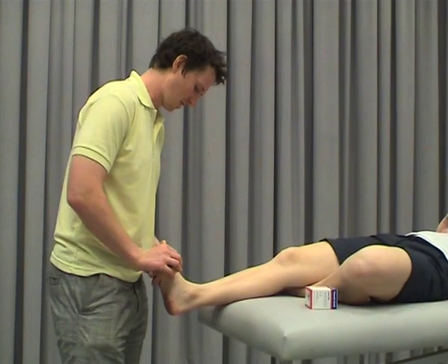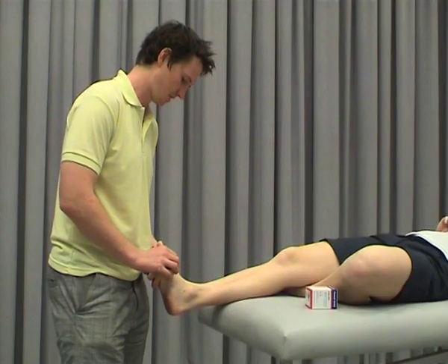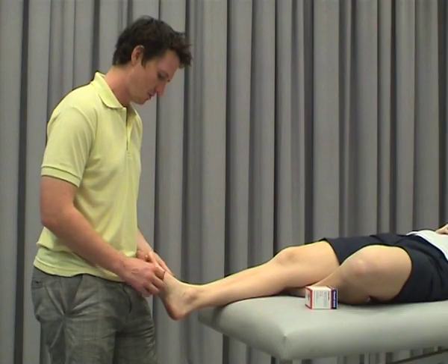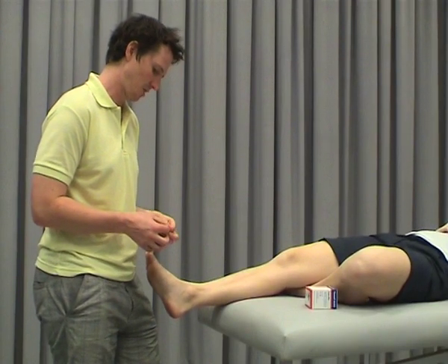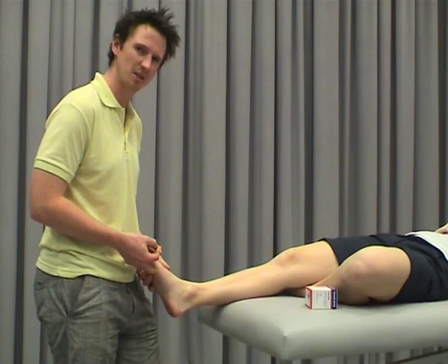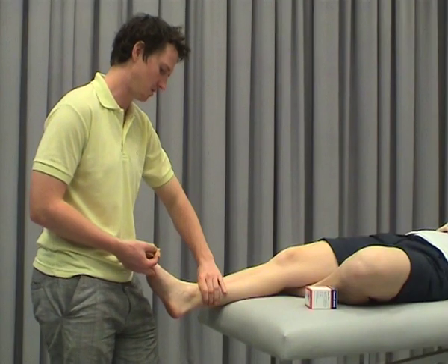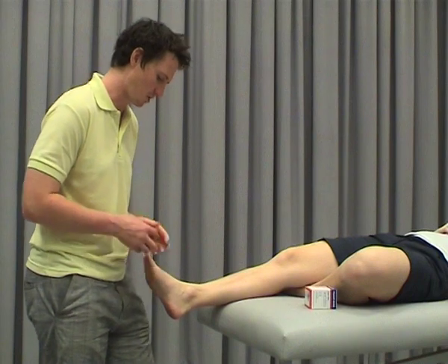What we're going to do is an augmented low dye taping technique which is designed to control arch through walking. The idea of doing augmentation to low dye has been shown to give much better arch control through walking and also through running. Just the low dye by itself pretty much wears off after a couple of minutes, whereas doing augmented — which also attaches to the tibia — has been shown to control the arch over a 20 minute period. So we'll do the low dye to start with.